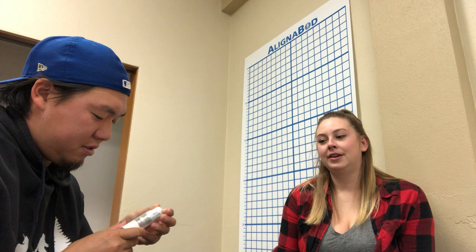Hi, I'm Yuzo Fujiki. I'm going to teach you how to use an inhaler. First, make sure this is prescribed to her — her name is not on this one, so it's not hers. Also make sure it's not expired. It says September 12th — it's expired.